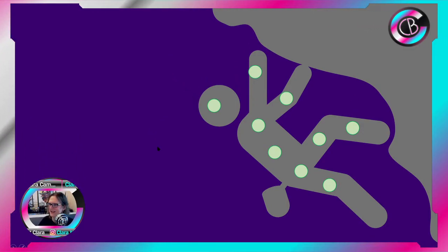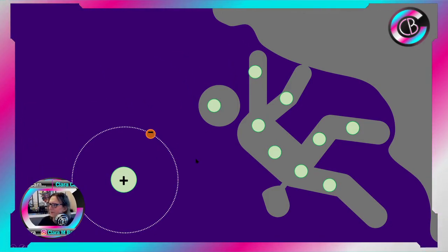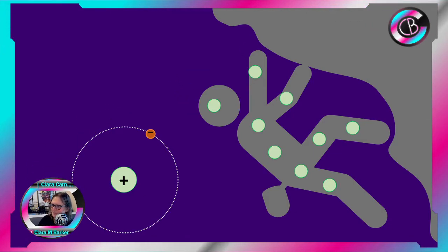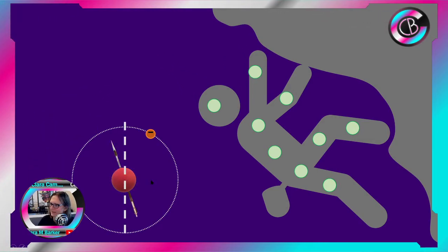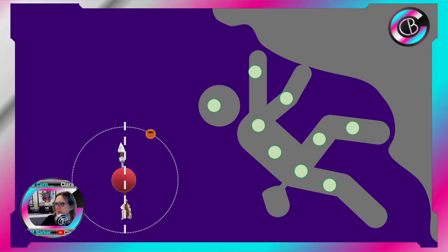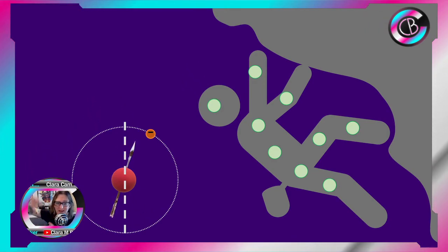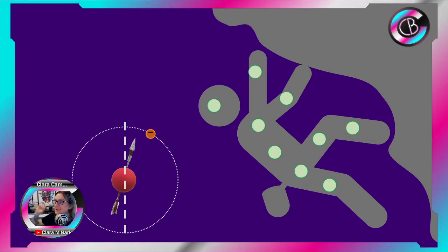And we talked about hydrogen atoms. They're pretty cool because it's just a single proton in the nucleus and then an electron. We talked about that in the last video, or touched on it at least. But it's interesting, these atoms actually have a slight magnetic moment. They actually spin. I've used an arrow to show you the direction of the spin. It's spinning around, and that is the direction of the magnetic moment, which is being produced by this atom spinning.